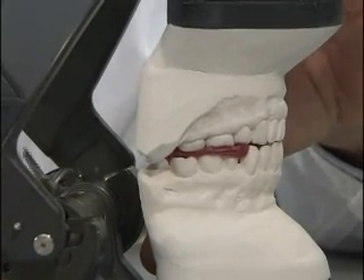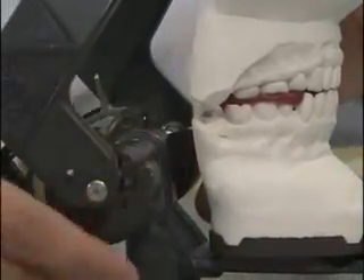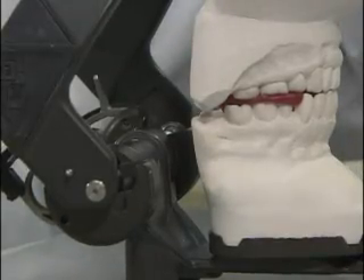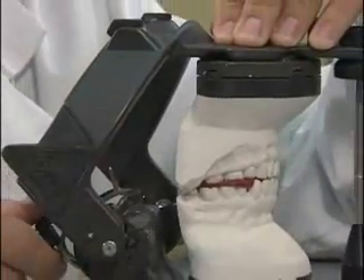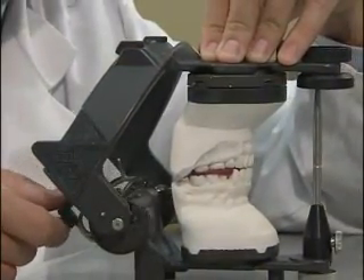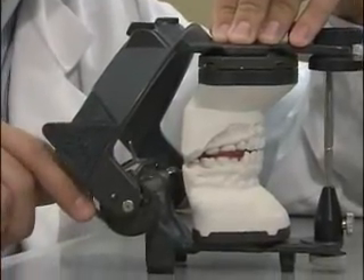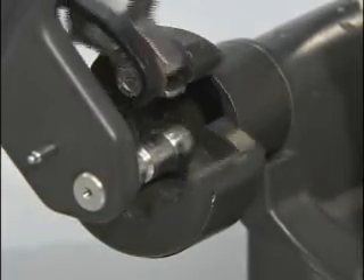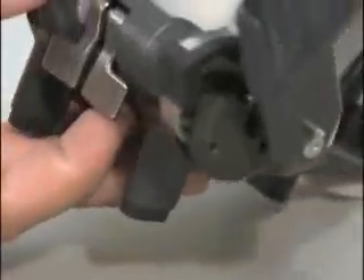Verify that there's no contact in the hinge boxes with the condylar element. Firmly press on the lower member, making this whole apparatus stable. Next, close the hinge box until you see contact between the hinge box and the condylar element. When you feel and hear contact, lock the hinge box at that point.